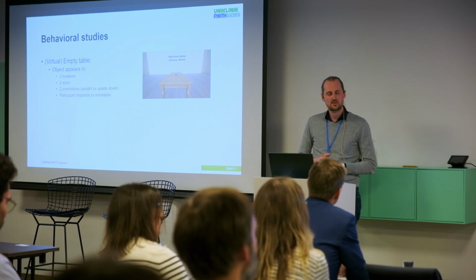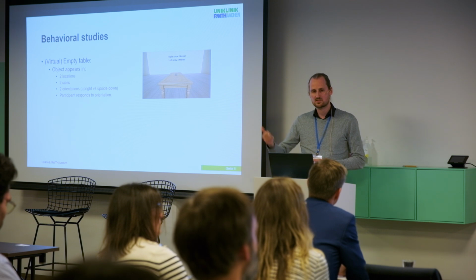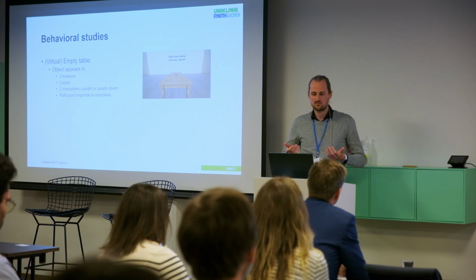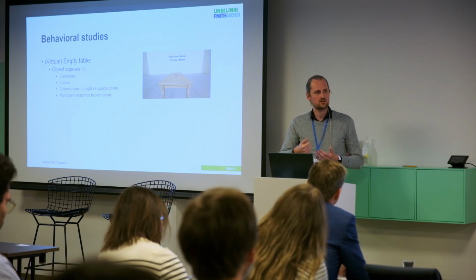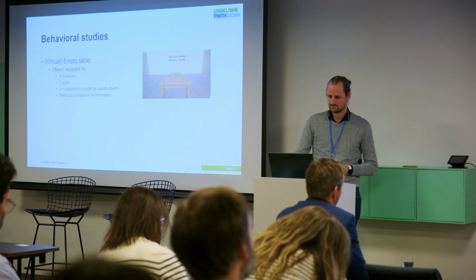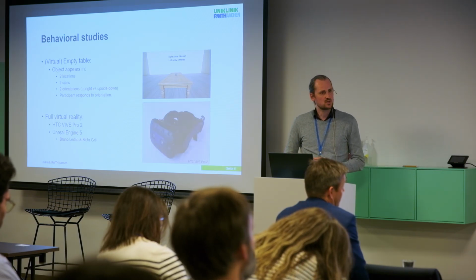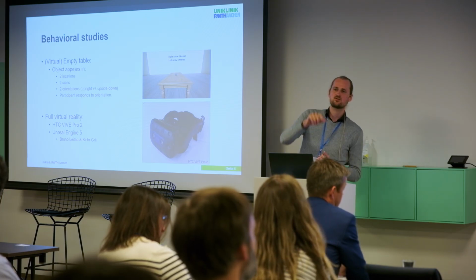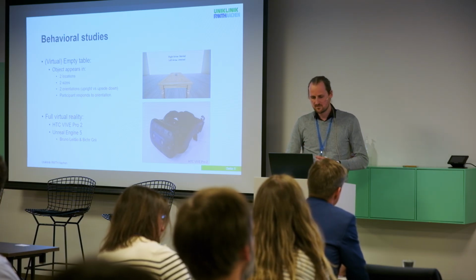Additionally, we presented this cup in 2 orientations, so either the cup was presented upright or it was presented inverted, upside down, and the participant was simply instructed to tell us whether the cup was upright or upside down using a keyboard button. We presented this to our participants in full virtual reality using the HTC Vive Pro 2. I think it's similar to the one in the back, but I think it's a bit different.